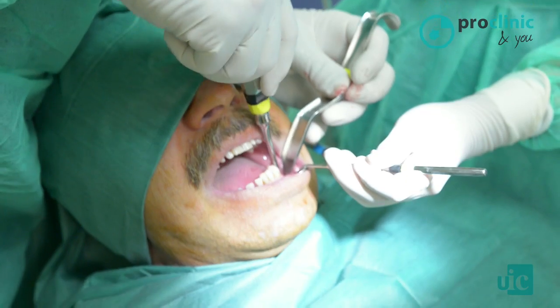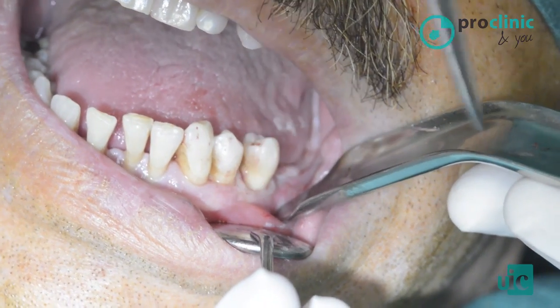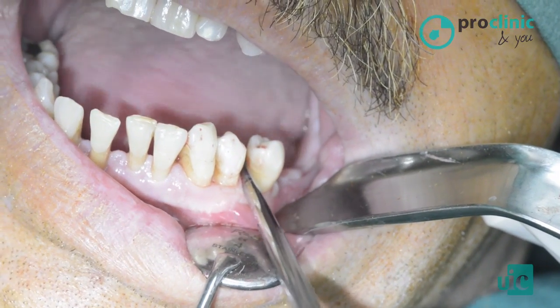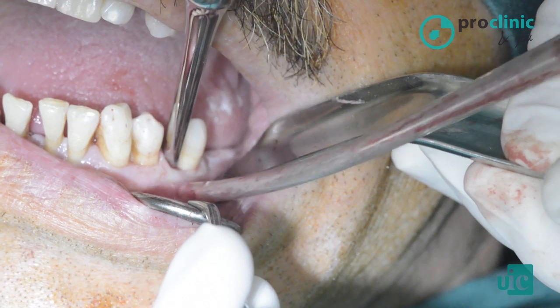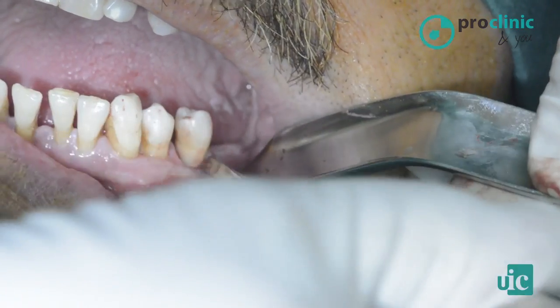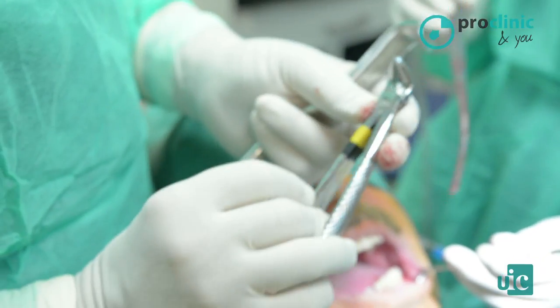This would be the movement. And notice that this is a wedge movement. The elevator can also be used with a lever movement. We need to pay attention to the wedge and lever movements. We will perform the extraction with these movements surrounding the tooth, all along the gingiva. And to finish the extraction, we are going to use forceps.